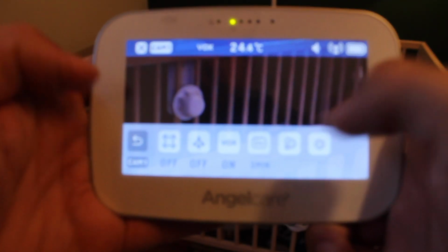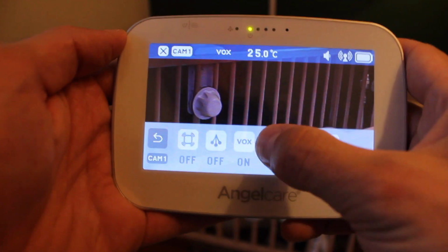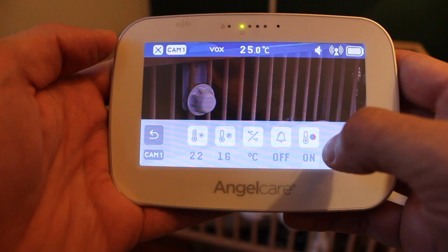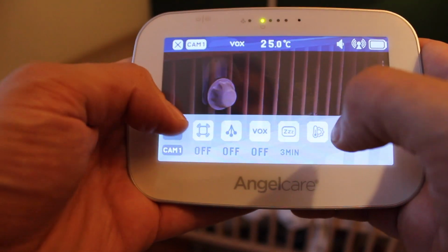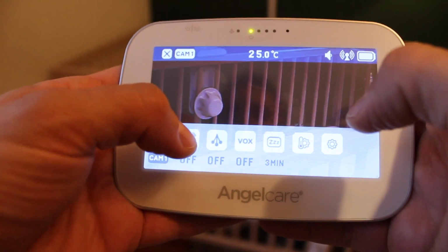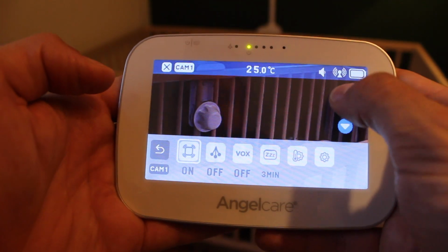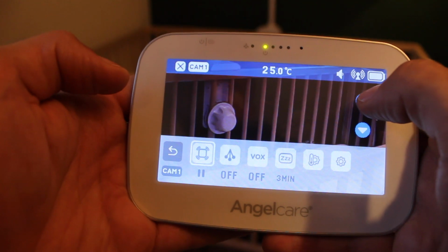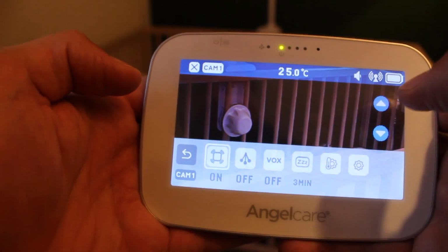So you've got a menu here which allows you to access all the different options, and you can tell it when we want to go to sleep. You can set the temperature settings, you can set the voice, you can set the sensitivity of the sleep monitor. So here we just turn it on, here it's pause, here it's off, so now it's on.